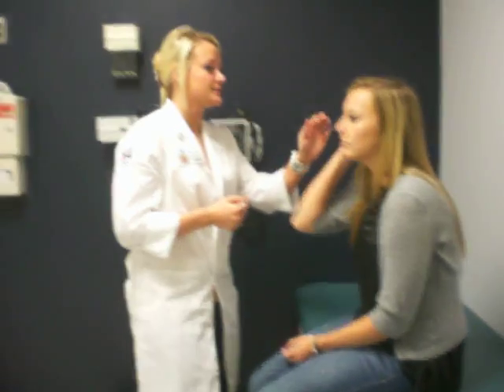Well, I'm going to be checking off your ears, nose, and throat today. And I'm going to start out with your ears. So if you could just pull your hair back for me.